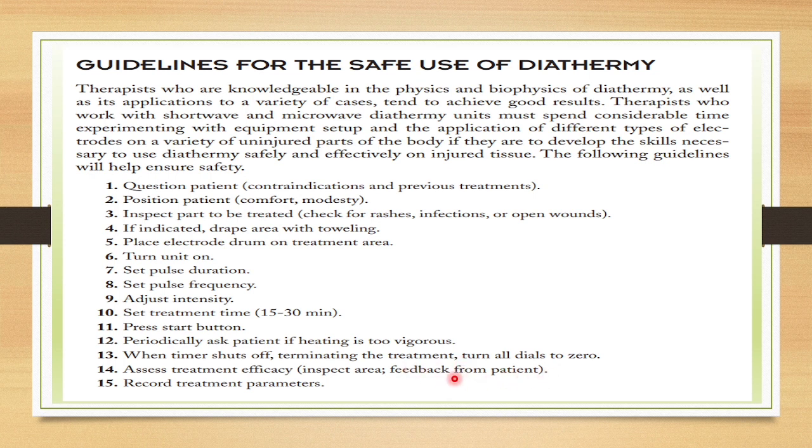So this is the feedback we need to get from the patient, and we need to tell it when we are planning for the next session. So all this we need to tell, and we need to record the treatment parameters. Recording the treatment parameters, documentation, is one of the important things you need to follow even in your clinical practice, because we need to be on the safer side.